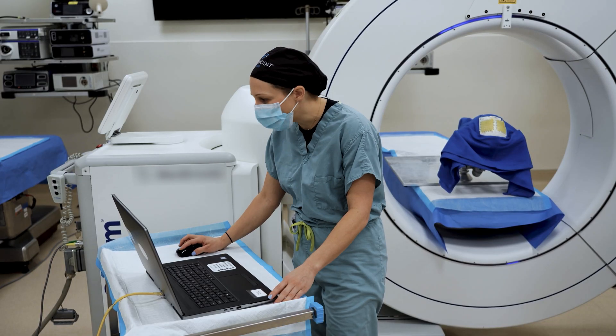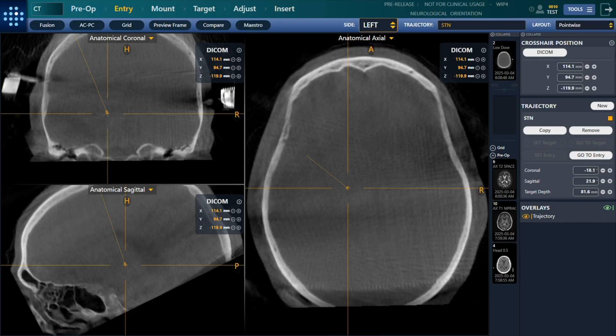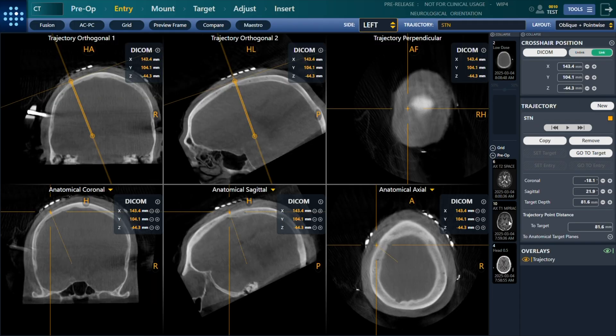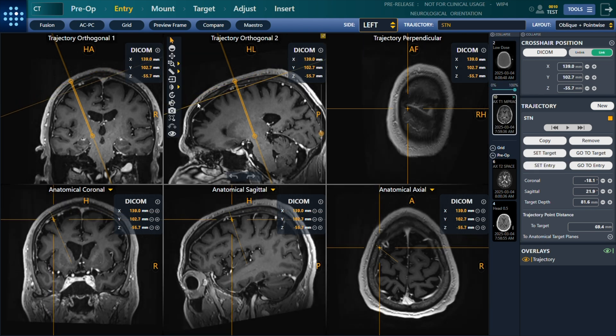A scan including the SmartGrid is used to register the patient. The ClearPoint system is compatible with low-dose ICT images across the registration, navigation, and confirmation scans. The registration scan is then fused to the pre-op imaging, and the user can review and modify their target or plan as needed.